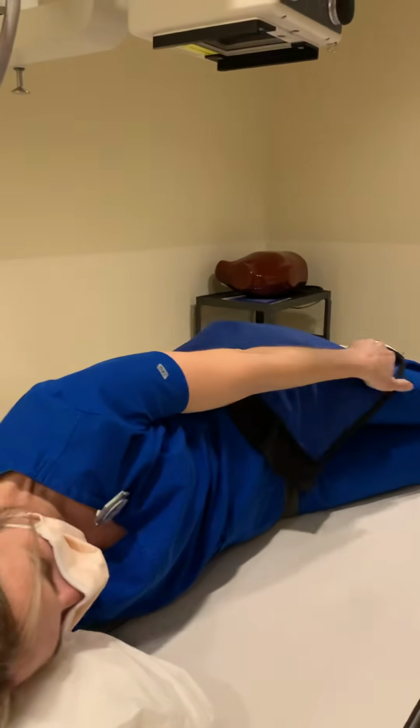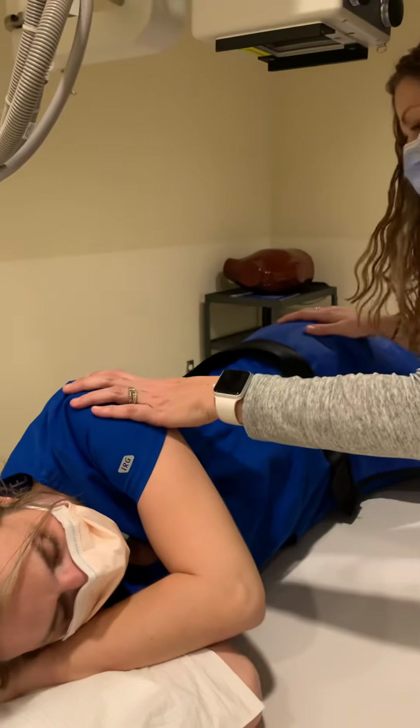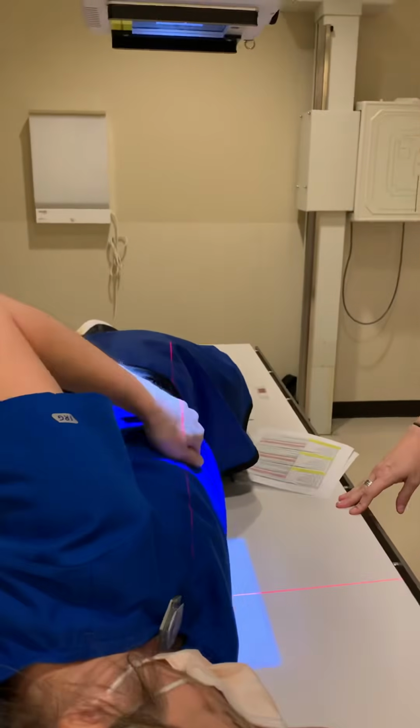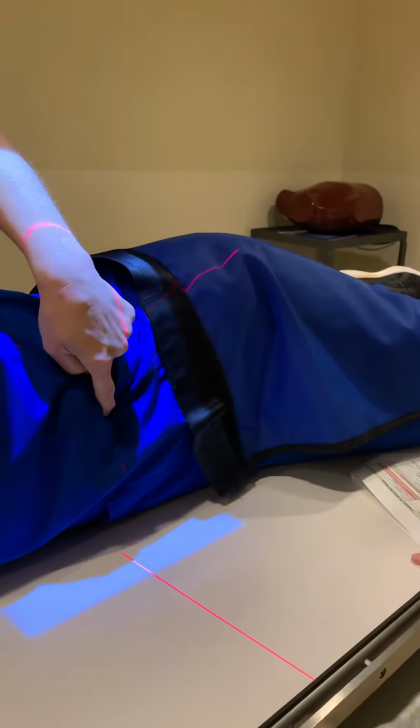Our patient will roll into a lateral position on the right side with the knees flexed. We anterior still will have a 10 by 12 image receptor in the bucky. We want to make sure the patient is not rotated, that they are in a true lateral position.